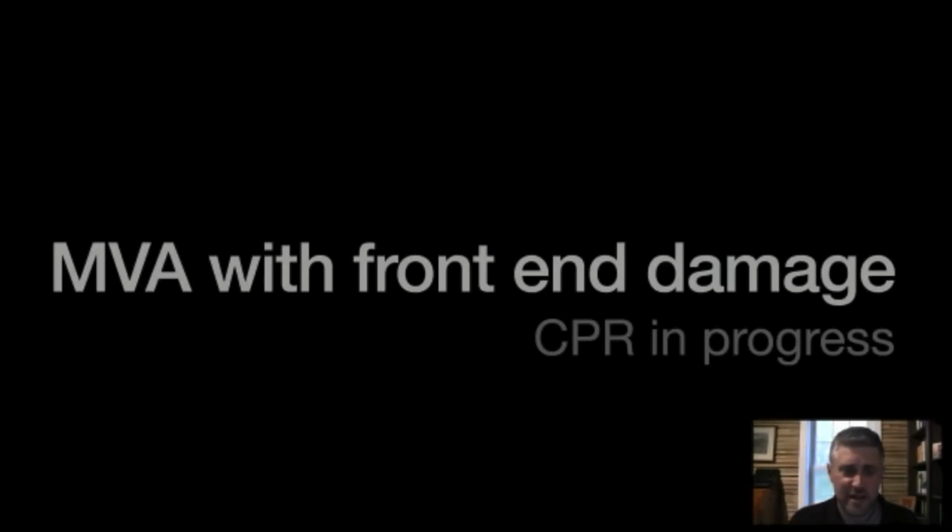All right. So our next case, we're going to dive into this one. It's a motor vehicle accident with significant front end damage. Patient rolls into the emergency department, CPR in progress. When you ask medics, hey, when did you lose pulses? There's something you guys in the EMS division are teaching them or putting in the textbooks. 100% of the time, they always lose pulses as we were rolling up.